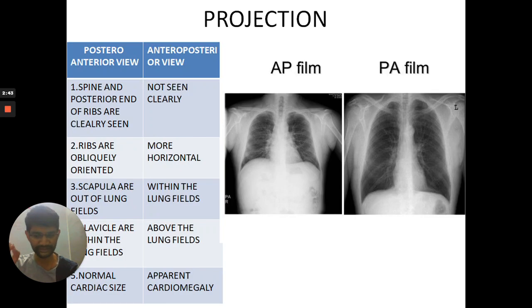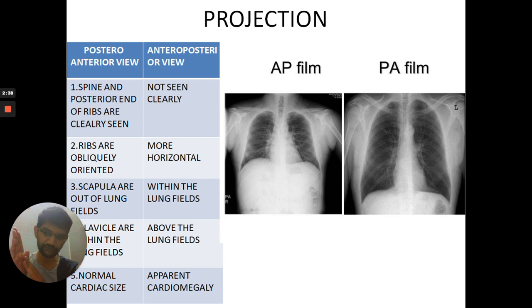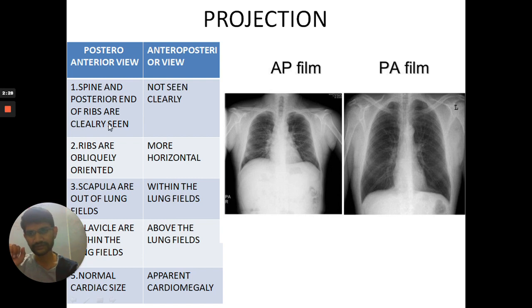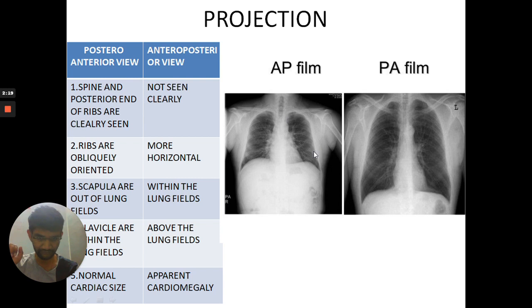Third is projection. Projection means whether the photons are passed from posterior to anterior or from anterior to posterior. Sometimes we also get lateral films. PA view and AP view are the most common. In PA view, the spine and the posterior ends of the ribs are clearly visible, as you can see here, and they are not so in the AP film.